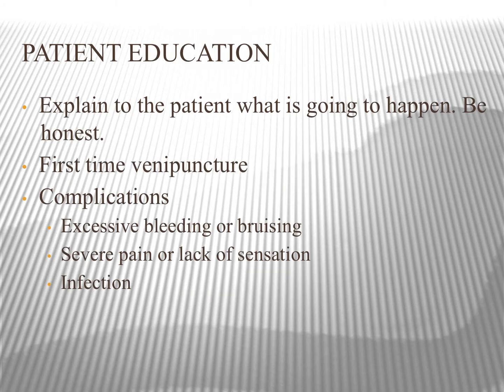Patient education is just as important as the actual venipuncture itself. Just explaining to the patient what's going to happen and be honest. So especially when you're drawing children, don't tell them that it's not going to hurt. We need to be honest with them. Tell them that it might hurt a little bit. They're going to feel a pinch, those types of things.